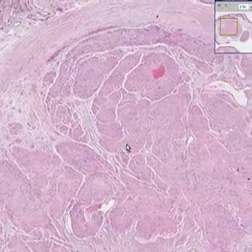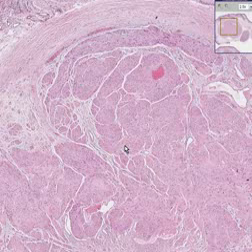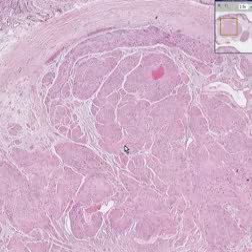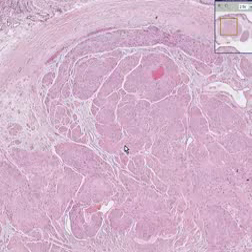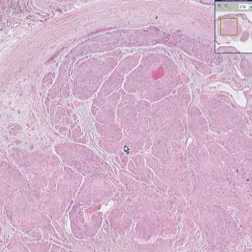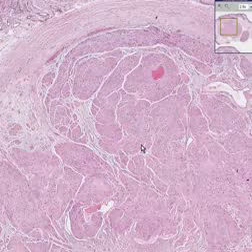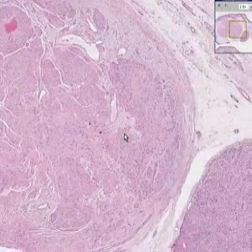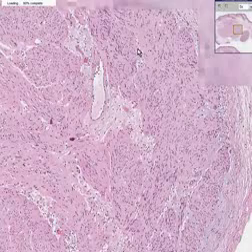This is a schwannoma. A Schwann cell is the principal cell of a peripheral nerve. It is the cell that makes myelin. It's the cell that myelinates axons of peripheral nerves. Tumors of these cells are called schwannomas, although we saw another case of when it was just called a neuroma. We also saw another case when it was called granular cell. But this is the classical or garden variety type of tumor, almost always benign, of a peripheral nerve called schwannomas.